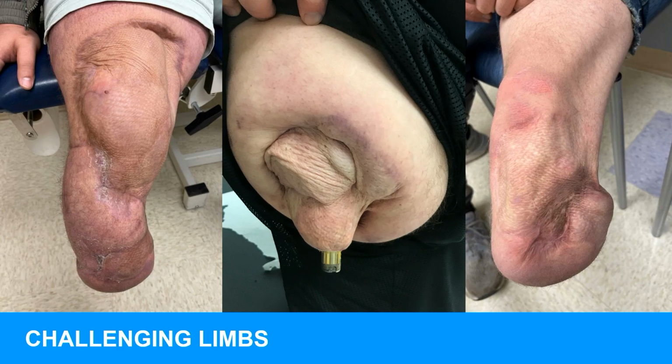But talking about reimbursement, look at these limbs. You're not going to make money fitting these patients. You might be able to make them happy, but you're not going to be reimbursed properly. I'm happy to say few of my patients have desired to look at osseointegration, but I work pretty hard. I'm not making any profit off of patients like this, but you're going to make their quality of life superior. These challenging limbs can do extremely well with OI.